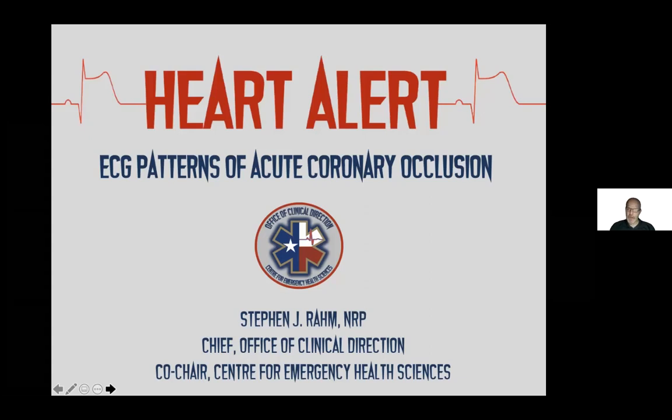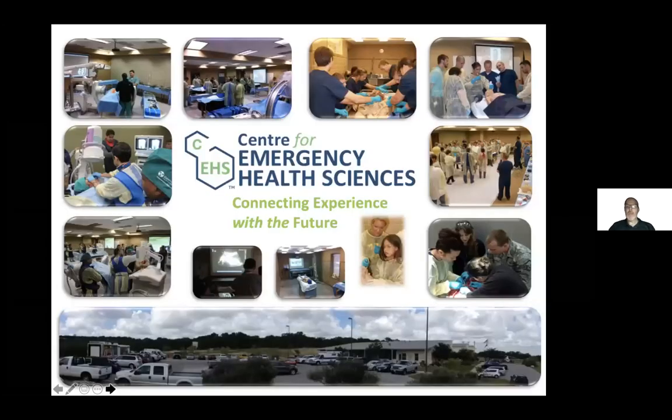Because there is a difference. And that's why this talk is about patterns of acute coronary occlusion, not just STEMIs. A lot of these are pretty obvious. Some of them are not so obvious.